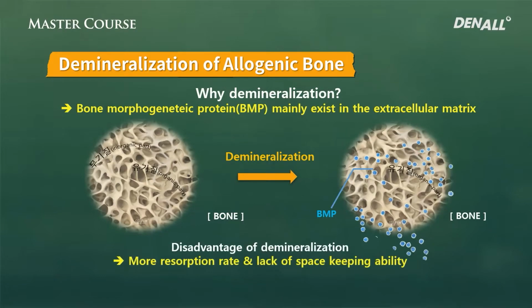But when we do GBR or bone augmentation clinically, DBM or DFDBA are not recommended to be used alone because of demineralization. They are highly resorbed and they do not have sufficient space maintaining capability.